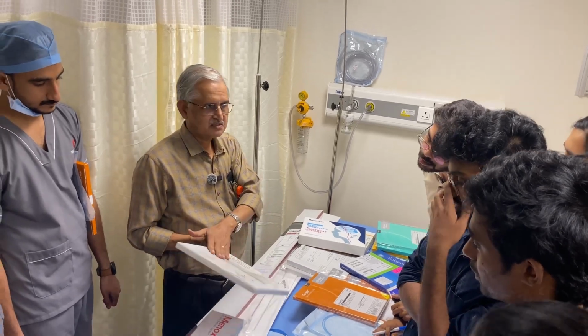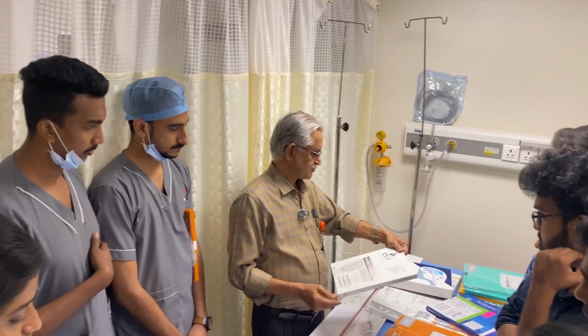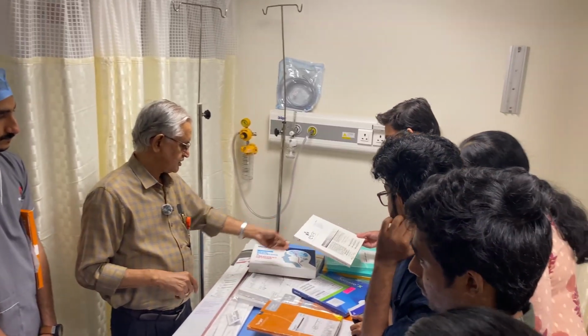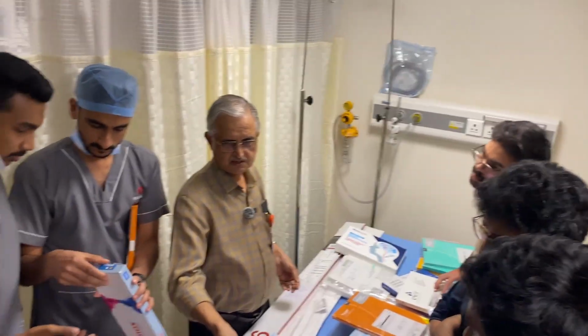So these kind of catheters have come, which can be safely used to detach and to inject embolic agents. So these are the Onyx. Onyx is the usual name, more people will know.